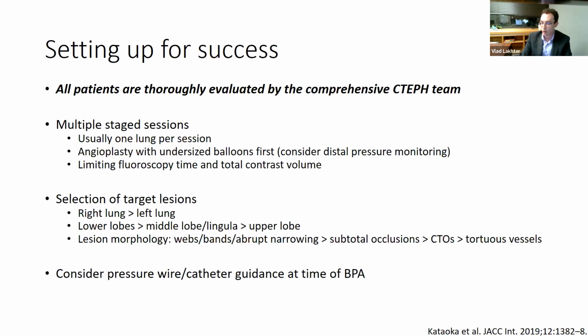Also consider the lesion morphology that you're approaching. Treating the webs, narrowings, and the bands is a lot safer, as you'll see, than treating subtotal occlusions, CTOs, or patients who have tortuous vessels. And then also consider pressure monitoring distal to the lesion, which I'll show you.